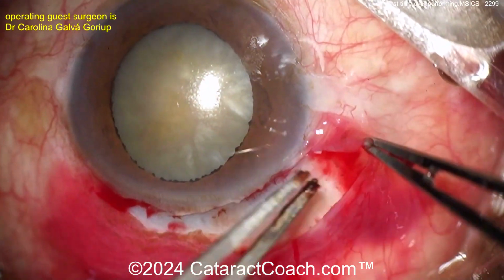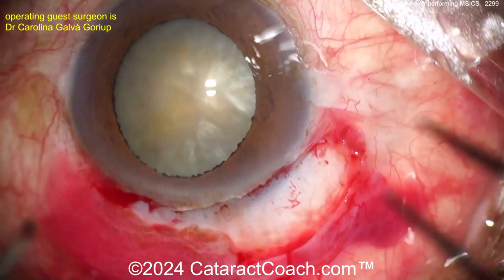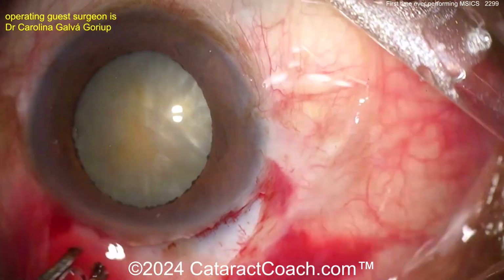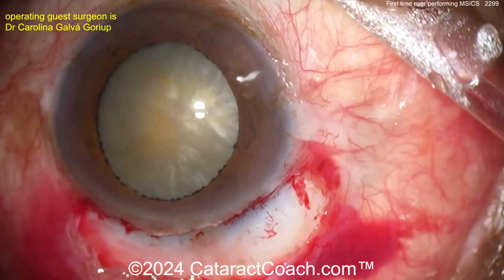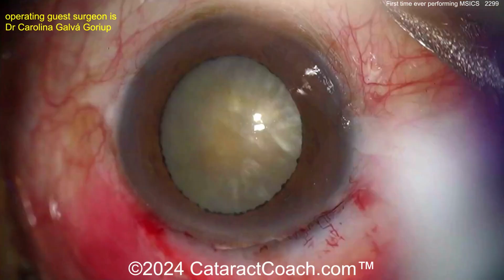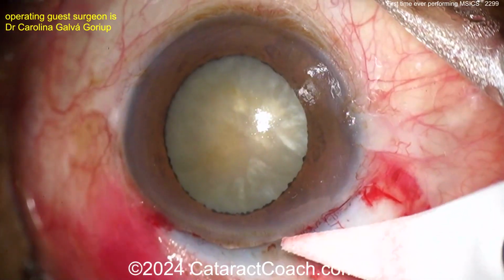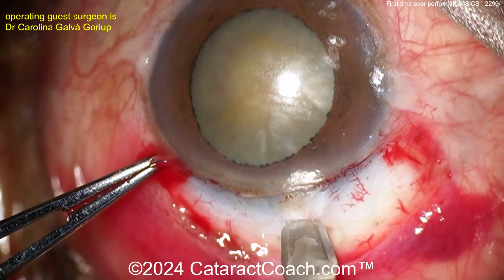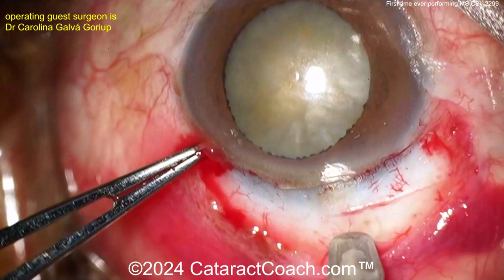And we've explained the incision before, but let's go through it again. The key to the incision is going to be half scleral depth, and it's going to be a long tunnel length, trapezoidal in shape. So let's watch here carefully. Now here comes the blade, crescent blade is what you want here, drying out the conj and the sclera. I like that, nice dry scleral bed. There we go. You're going to go about 2 millimeters back, and there's the half scleral depth groove.